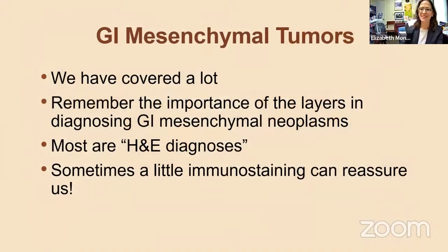So we've covered a lot of stuff. Do remember thinking about the layers. Most of the lesions are just H&E diagnoses, but of course we all need a little hand holding sometimes, just like I did in that mucosal neuroma that I just showed you.